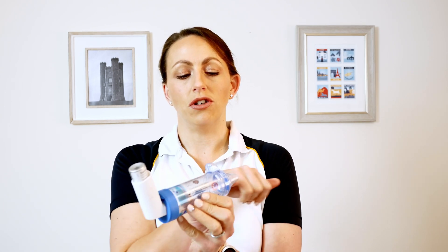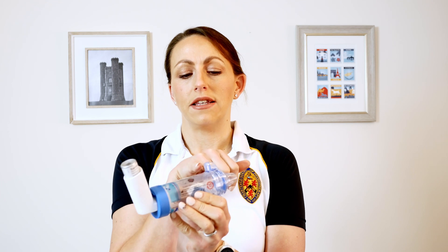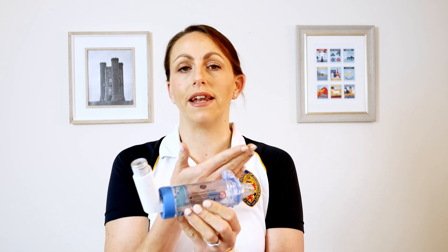Make sure you get a good seal around the mouthpiece. This particular one — the flow view — has a little flap here, so if this isn't moving then you haven't got a good enough seal; you're not getting any airflow in and out to actually draw the drug into your lungs.